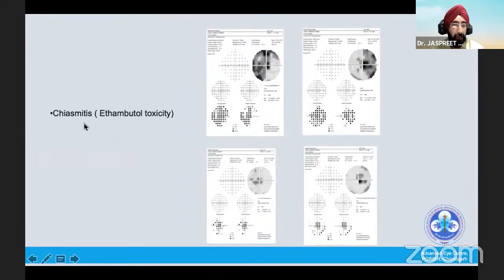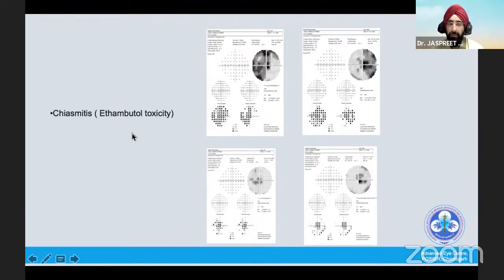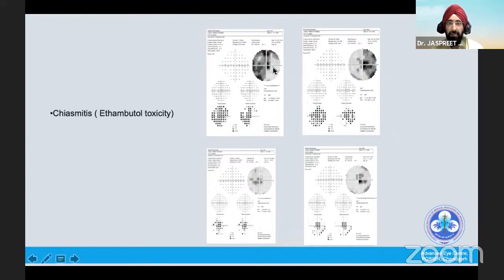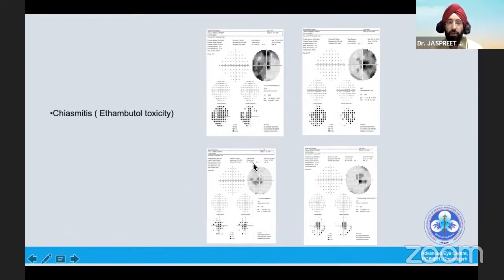The other thing I was talking about is chiasmitis. With so much tuberculosis in this country and patients on ATT, ethambutol is one of the important causes of optic neuropathy. You can see a bilateral central scotoma as shown here — but what this patient also had, if you see the gray scale, is a central scotoma and a bitemporal defect. On imaging, we could see some enhancement in the chiasma. The vision was quite low because of this central scotoma. After some time the chiasmitis resolved, but the patient still had a central scotoma. These patterns sometimes give you a clue as to what the inciting cause is and where the lesion could be.